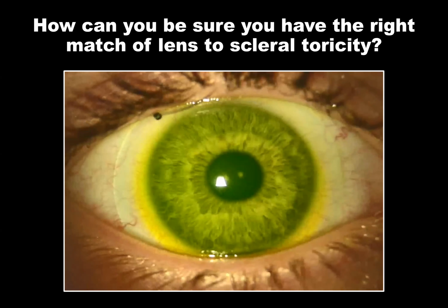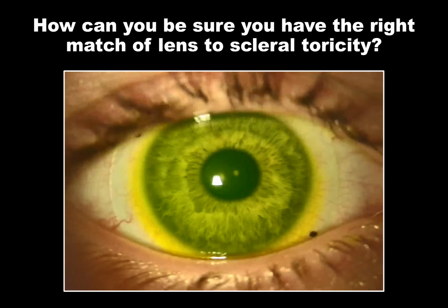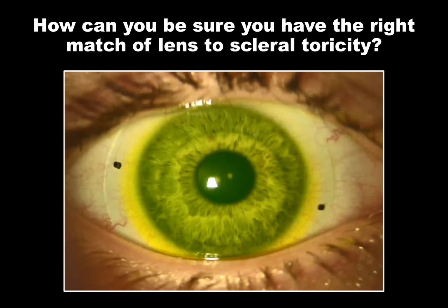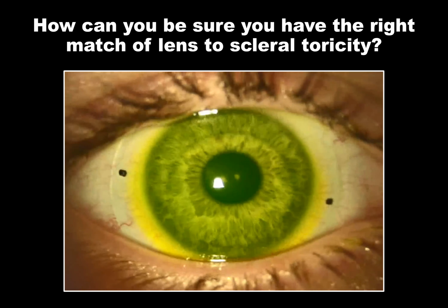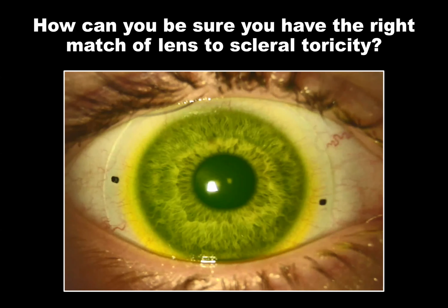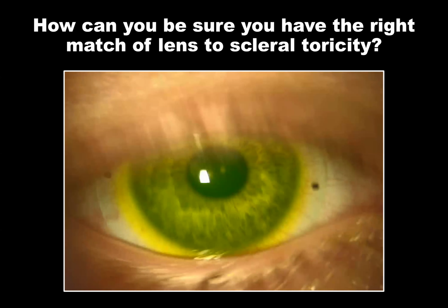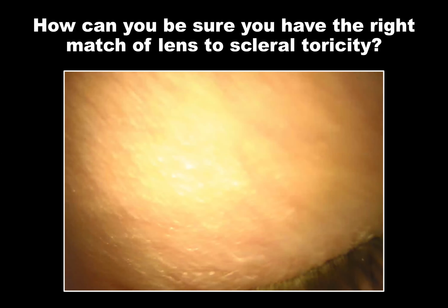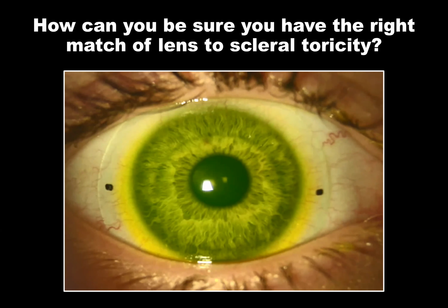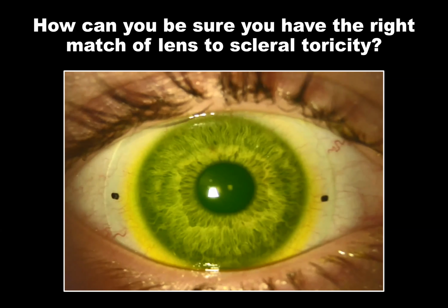And if you've got that right alignment like this lens does, where you have the perfect match or at least a near perfect match of toricity of landing to toricity of sclera, that lens will be incredibly stable. You know, look between blinks. If there's any rotation of that lens, it's incredibly small.